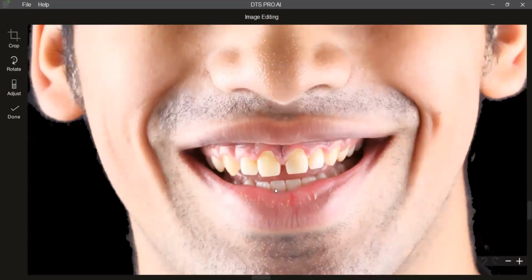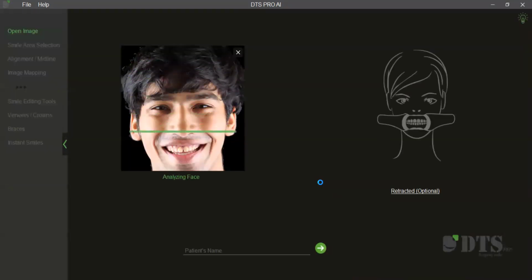One important suggestion, of course, is to always have a little gap or a space between the upper and the lower teeth. So a common clinical tip here is asking the patient to say the letter A and then smile. The moment your patient pronounces the letter A, or some of us use the letter E, the moment you say A or E and then smile broad, you typically get what you are looking for in a simulation photograph, that is a good display of teeth and a little intra-incisal space. So these are the two basic requirements.